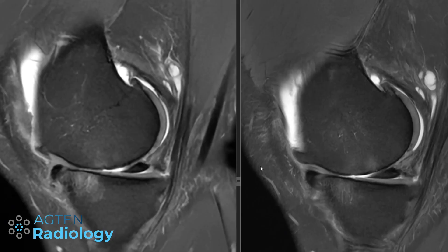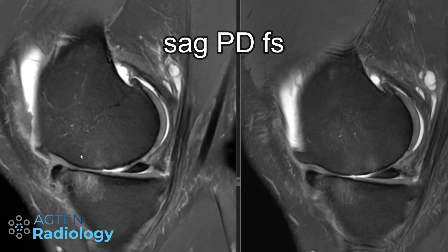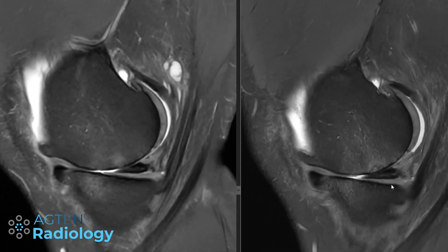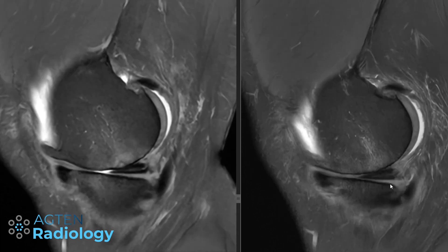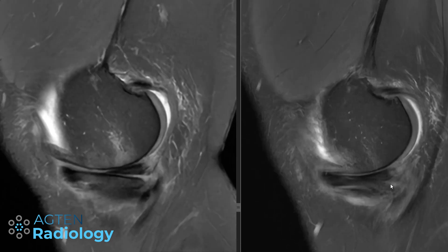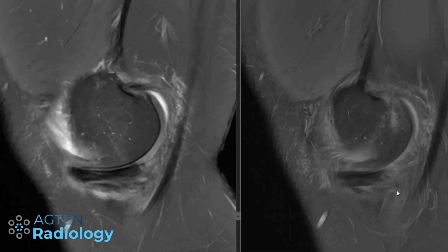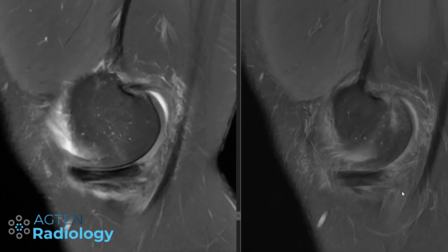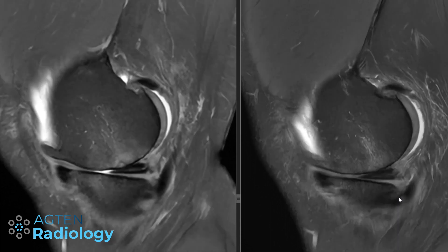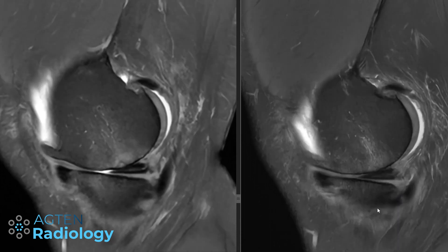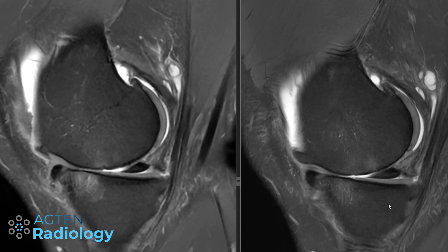So here we have two sequences — sagittal PD fat sat — same patient, same knee, same side. You can see both look quite nice and I'm just scrolling through slowly for you to have a look. It's not quite the same location of the slices, but for the purposes of this video comparing the 5-minute protocol versus the standard protocol, it's sufficient.